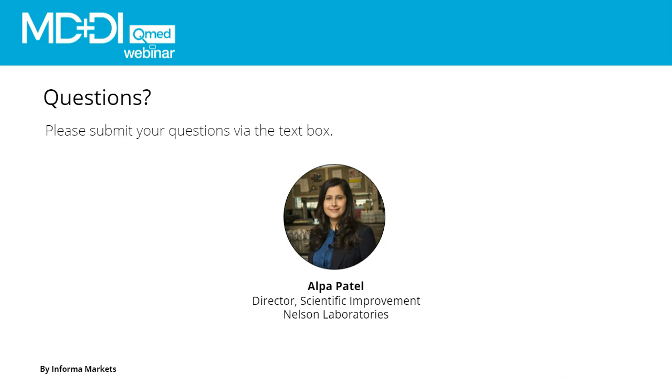Okay. Next question. During the design stage, how do we decide to what level we need to disassemble the device for it to be reusable? That's a very good question. When you start to see that there are areas where test soil is going to go, or bodily fluids are going to be trapped, that there is no accessible through flushing or even brushing, that's when you have to start deciding that we will have to pull it apart to make sure that those areas are accessible.